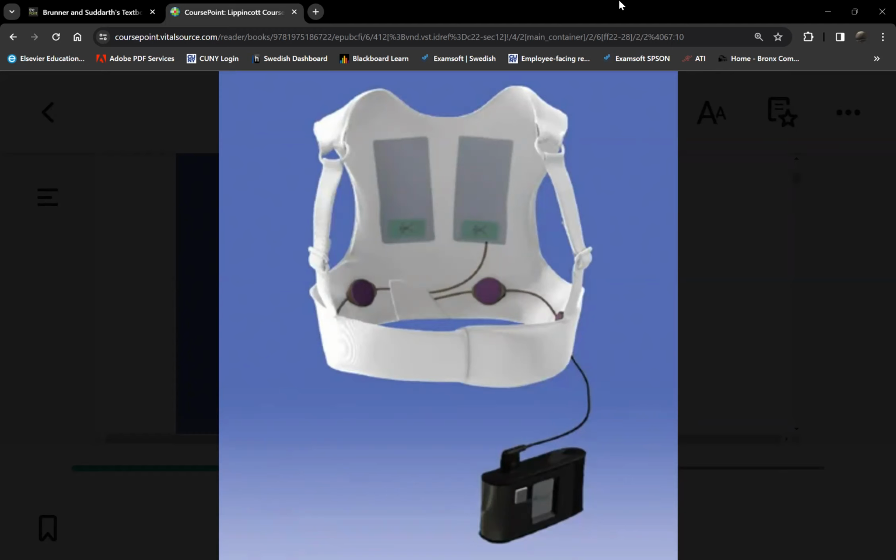So when I visit homes and they have a LifeVest ordered, I see them in a pile of laundry or under newspapers. So when I ask the patient, hey, why aren't you wearing your vest? It's somewhere there. I mean, you start sweating, right? Let's say it was in Florida when I did home health care. So you think this is comfortable to wear in tropical weather? No. You sweat, they itch.